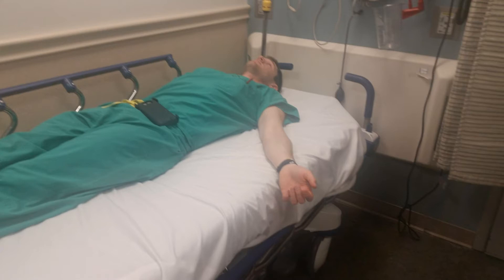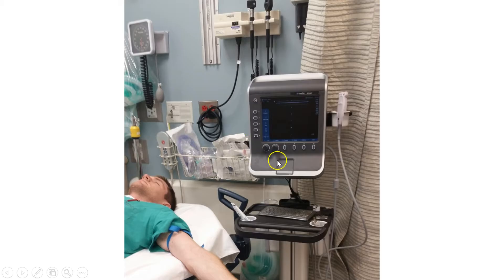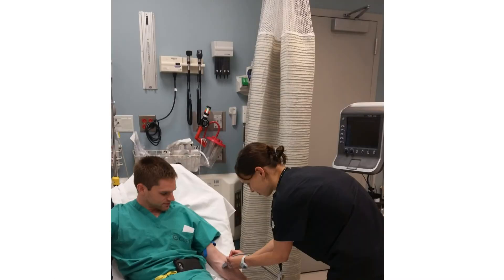And finally, what you'll need is a patient with an arm. Positioning is one of the toughest things to do well. You want to make sure the patient is laying in the bed, scooted over with their arm open for you, because most of your veins are on the medial aspect of the upper arm. You want to try to put the ultrasound machine behind the patient, because if it's in front of them you're going to have difficulty. You typically don't want to do this with the machine behind you and the patient in front — it makes it particularly hard to cannulate the vein.